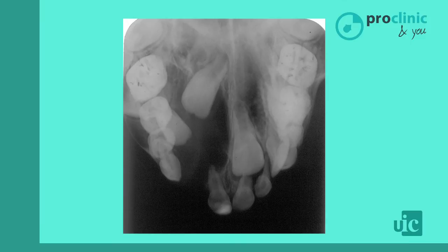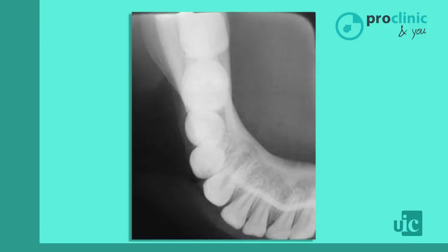And finally, we have the occlusal radiograph. The main function of the occlusal radiograph is to observe pathologies in the nostrils, in the maxillary sinus, or also to look for possible fractures at anterior teeth. It can also give us an image of the presence of small stones in our salivary glands.